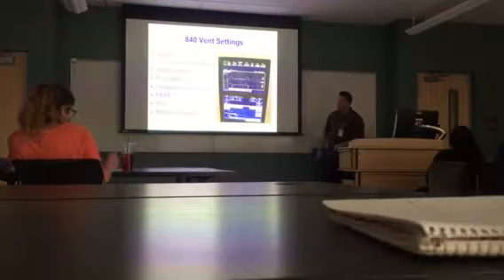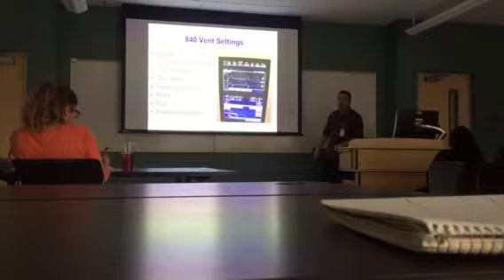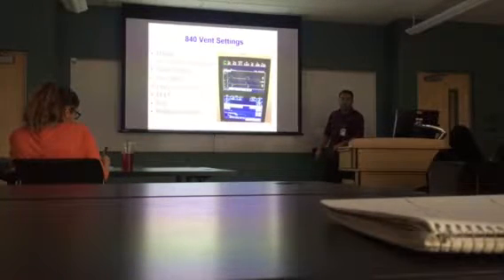And another term you have probably heard is pressure support. Pressure support is any time a patient is breathing spontaneously.